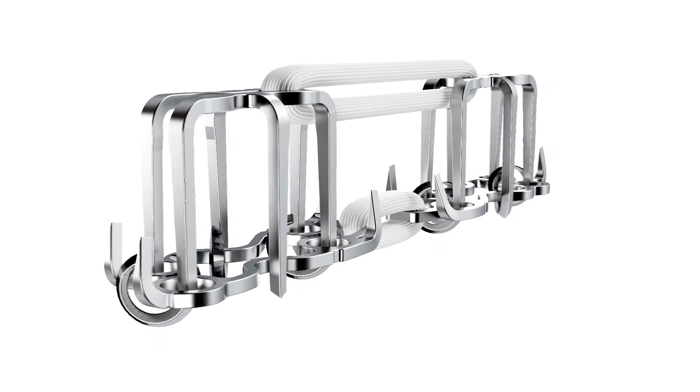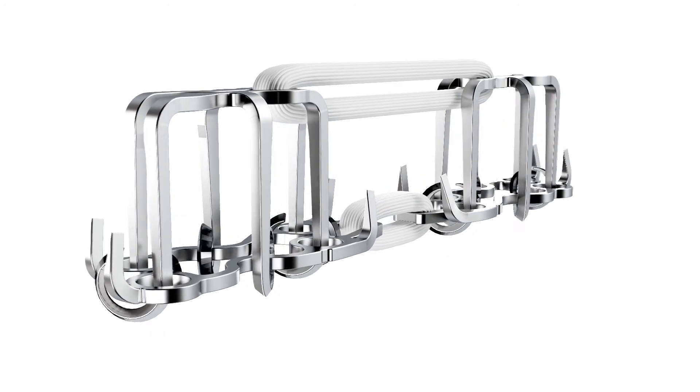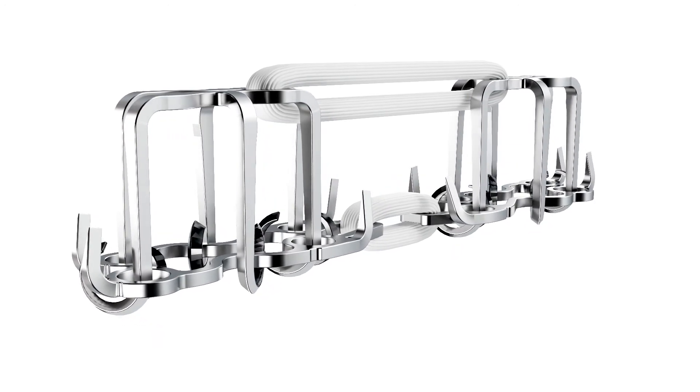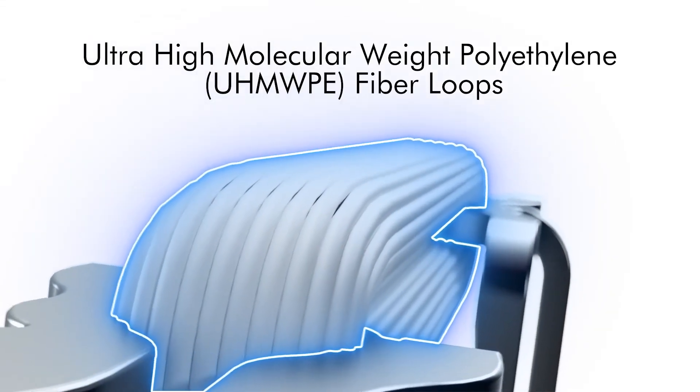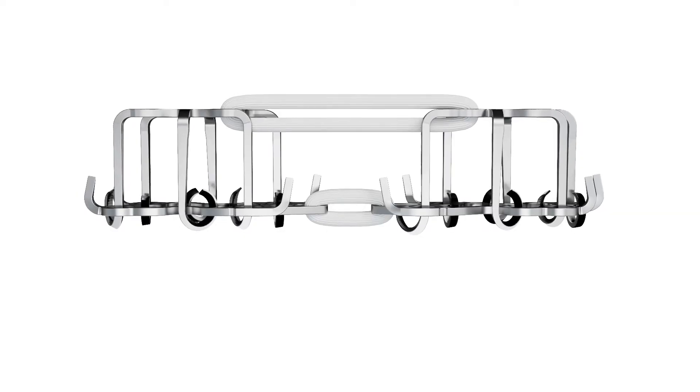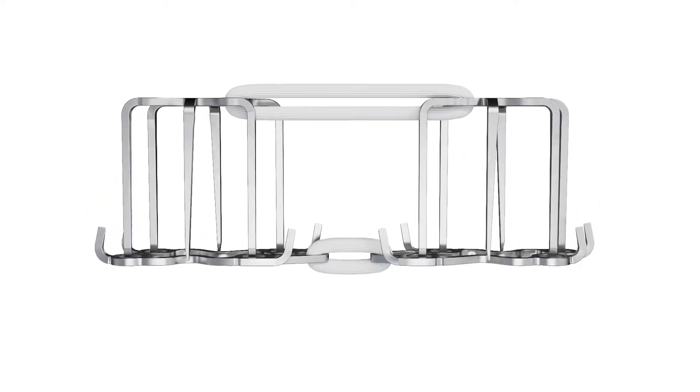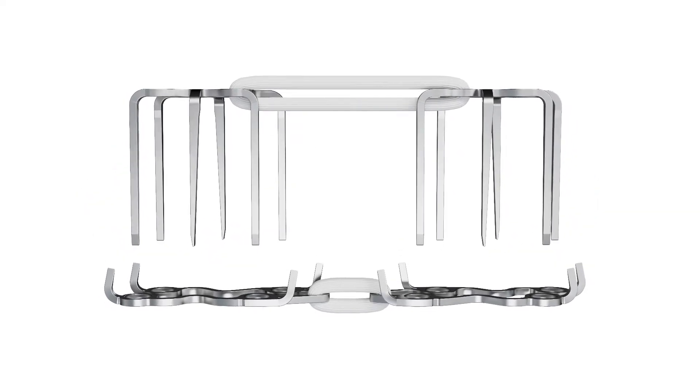The Connections TR implant is made from 316LS stainless steel and ultra-high molecular weight polyethylene yarn that is wrapped to form a loop that connects the stainless steel components and allows the implant to flex during natural tendon gliding.